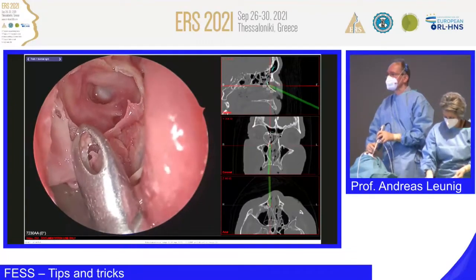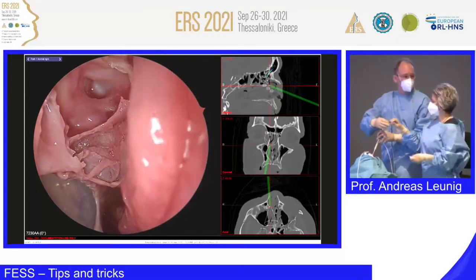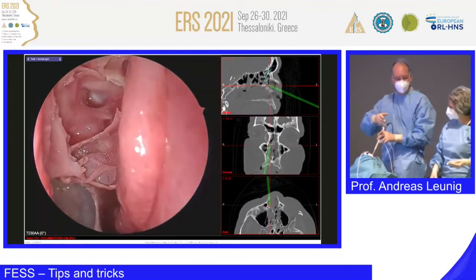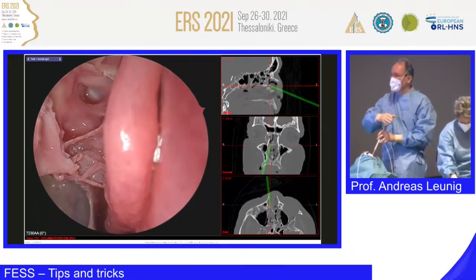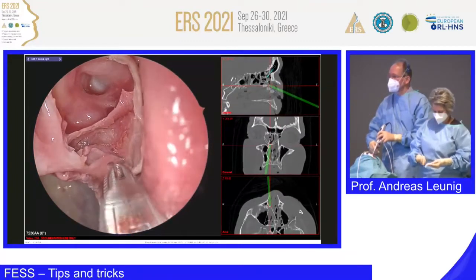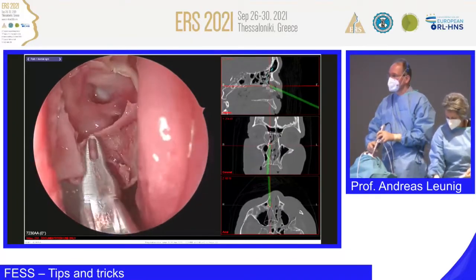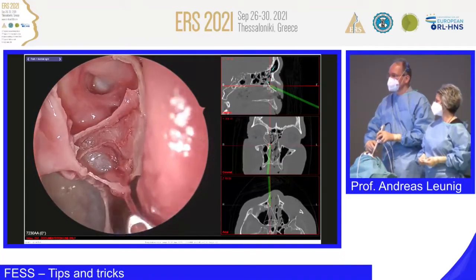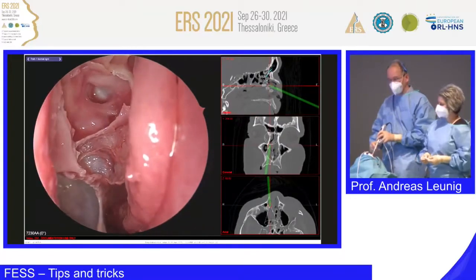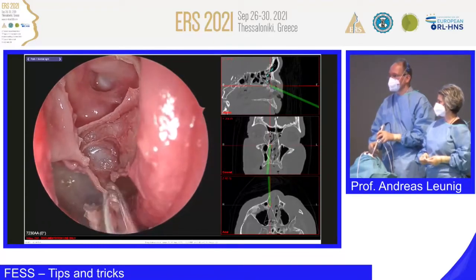Do you ever use through-cutting instruments to avoid tearing? Yes. Thanks, Sean. I was thinking you are reading my thoughts. Yeah. So please give me the through-cutting instrument, because here it's a danger. Through-cutting Blakesley. Now, in case you want to do it very automatically, you take this instrument and we nibble it away a little bit. Oops. Okay, yeah. When I tear mucosa, this is of course for demonstration. And now the tiny lamellas, I take it out like this here.